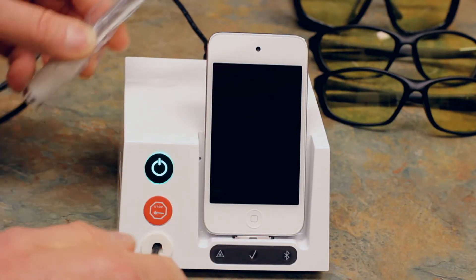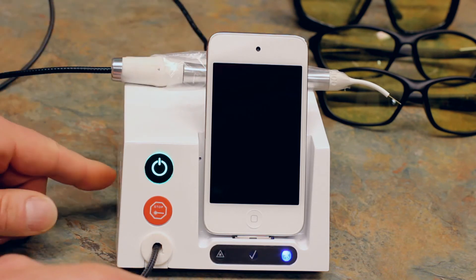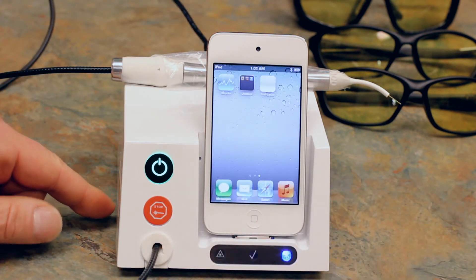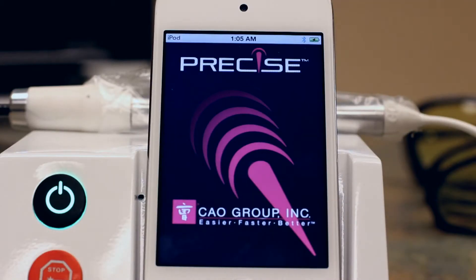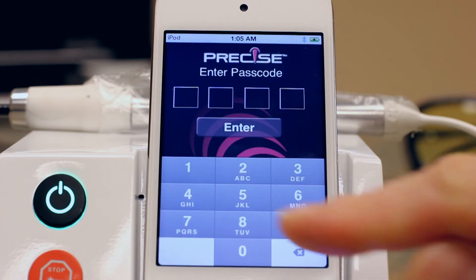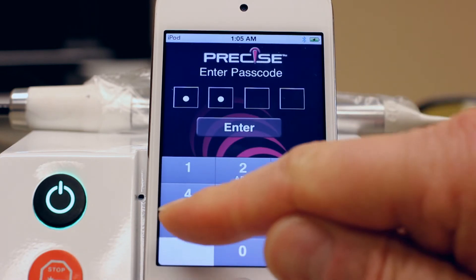Make sure that the handpiece is fully assembled with the handpiece sleeve and a disposable tip. Turn on the display and base modules, navigate to the Precise SHP app and start it. Enter your passcode and then select the operate screen.